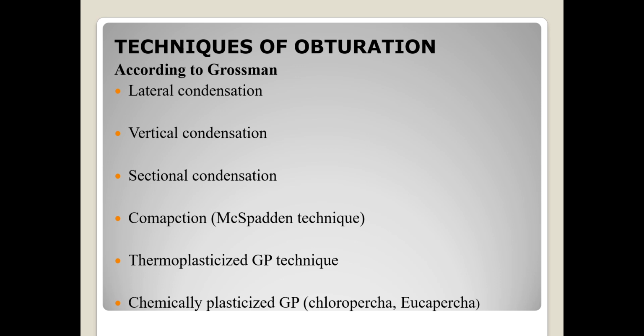Coming on to the techniques of obturation, according to Grossman: lateral condensation, vertical condensation, sectional condensation, compaction by McSpadden technique, thermoplasticized GP technique, and last, chemically plasticized GP.